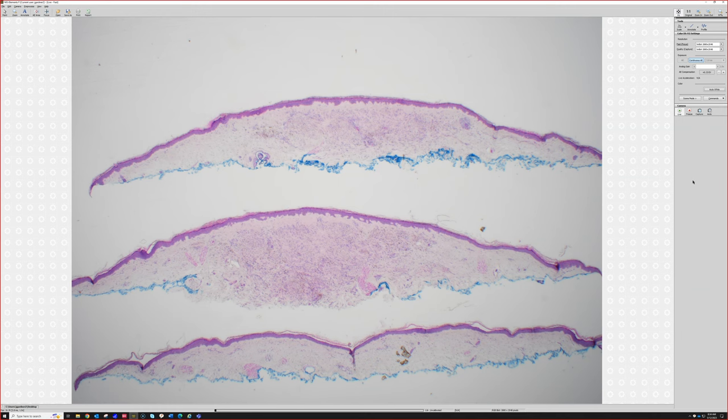Shaped, and I feel like I see some pigment. I was thinking about like a cellular blue or like DPN. Good. Yes, this is a blue nevus. To me, I would not call this cellular, but there are variable opinions about how much is enough for cellular.